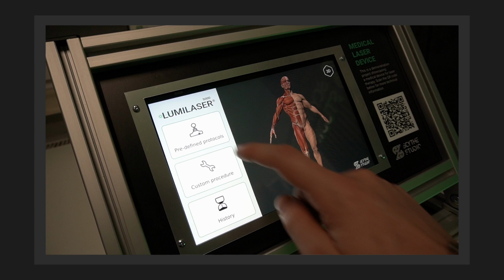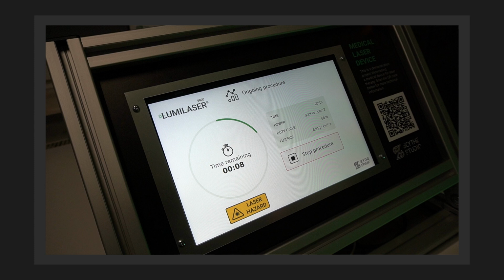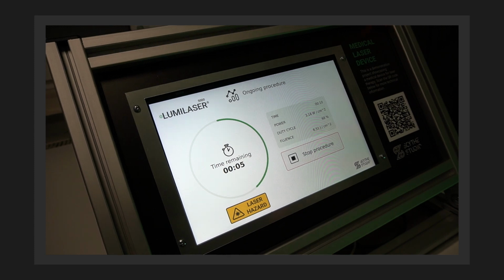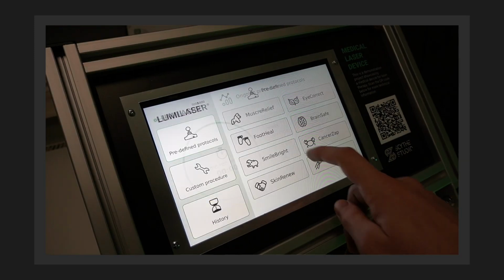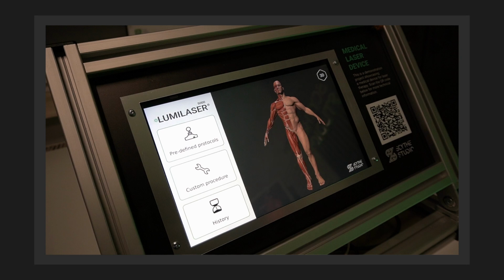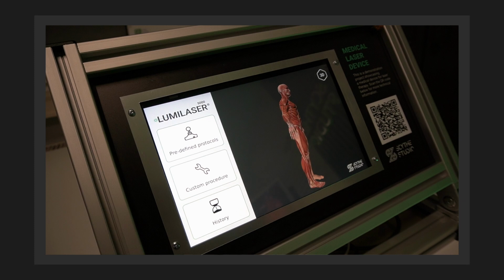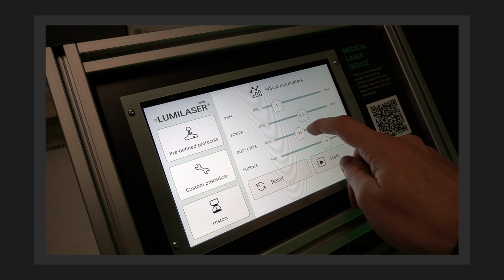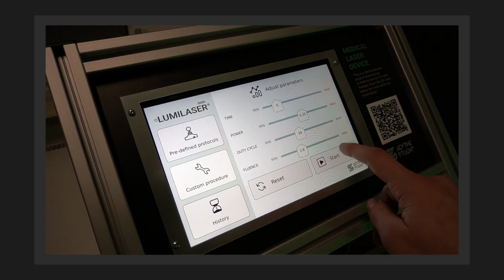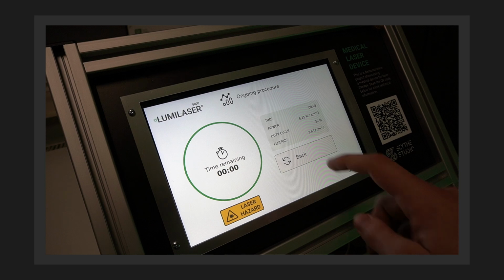Here we have a demo that mimics a medical device used for laser treatments. Such projects are usually closed physical devices with no need for spectacular UI effects, no need for real-time requirements, and so on. So here we've chosen to go with a custom Linux image, so our operating system has only the things that it has to have to operate in a way we want. It increases the security and it reduces long-term maintenance costs as there are fewer components to take care of.